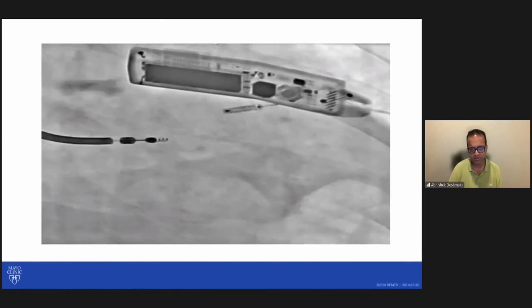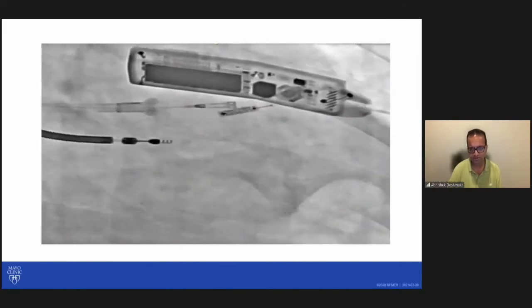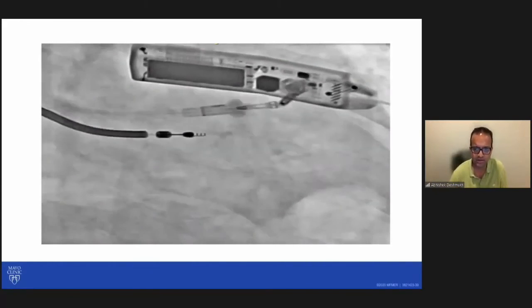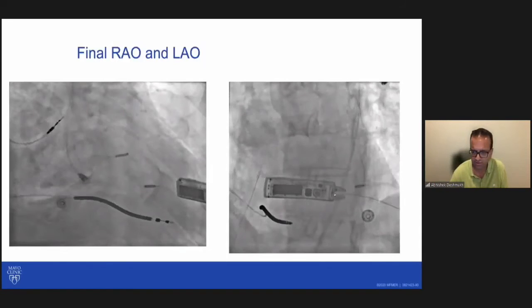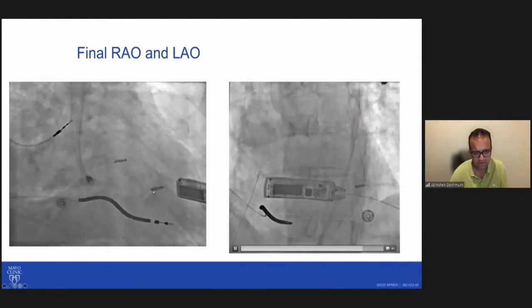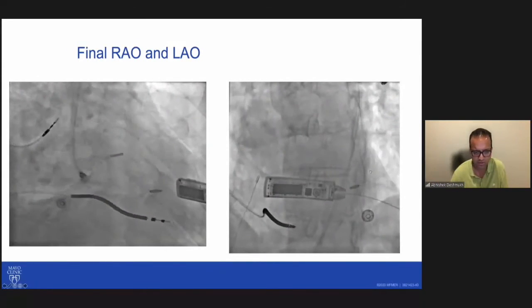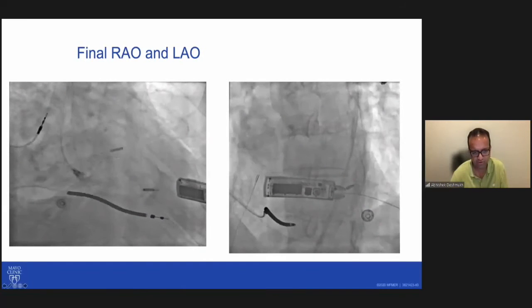Now, once this electrode is deployed, the transmitter will hopefully emit ultrasound energy, and this electrode will convert that energy into electrical energy and cause LV stimulation. This is the final picture, a good location here. And another good part is that you can always check sensing as you move along different parts of the endocardium, and you are really not limited by the choice of a vein, which one may encounter when we are doing a traditional CRT system.